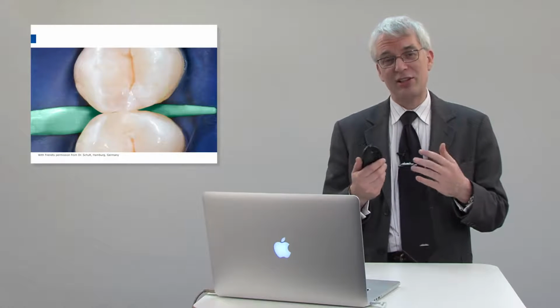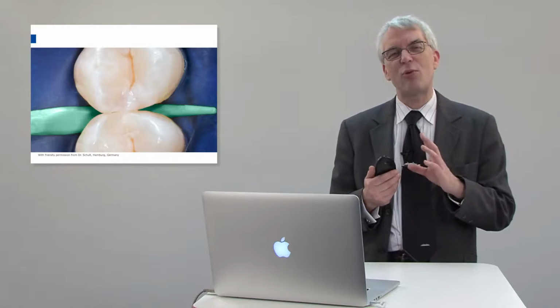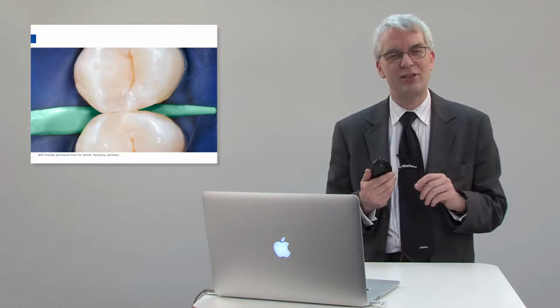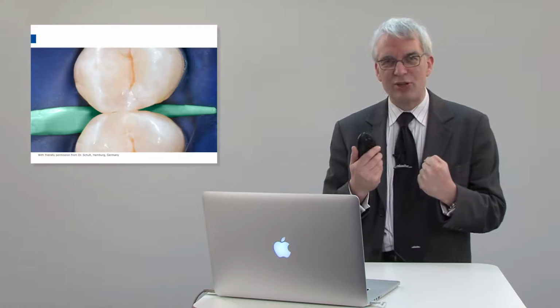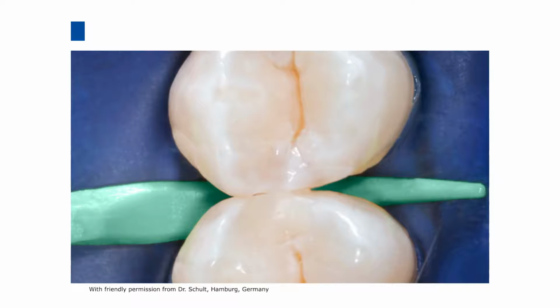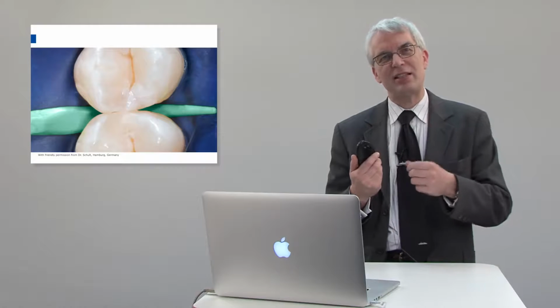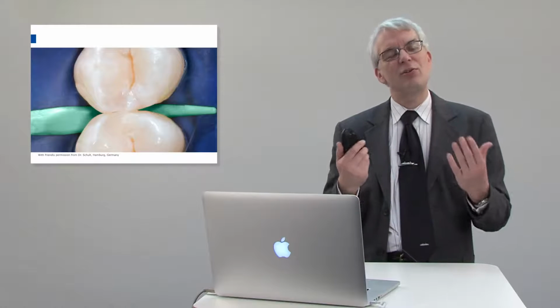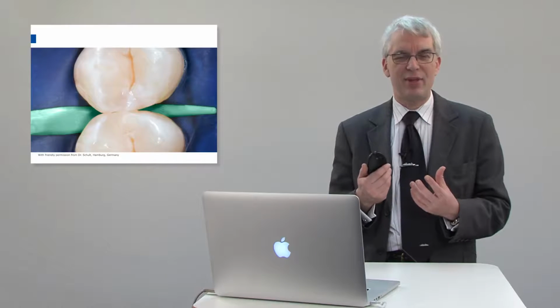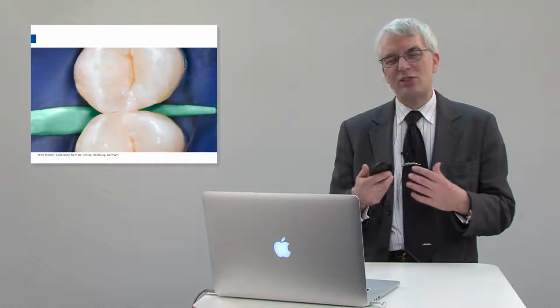In the video it says this is only felt as a small pressure on the teeth by the patient. But one of my colleagues, more than 4 years ago, was one of the very first Icon patients. And she had very tight teeth. She wanted that treatment because she believed in the treatment concept, but she can still recall how nasty it felt when that wedge was placed. So if you place the wedge, do it in a step-by-step thing. And if you want to avoid using the wedge altogether, you can use these orthodontic rubber bands, and they work nicely as well. But now let's assume everything is fine.